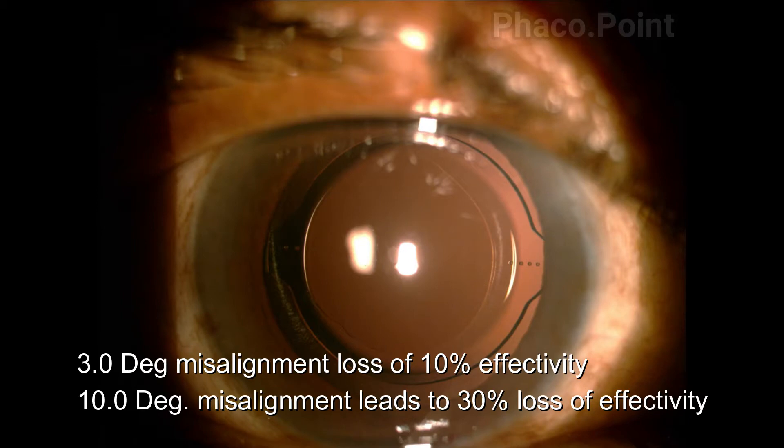A three degree misalignment can lead to a 10% loss of effectivity, while a 10 degree misalignment can lead to a 30% loss of effectivity.